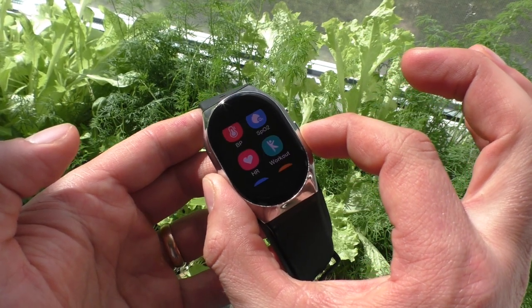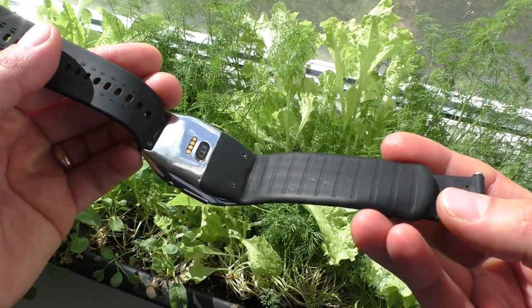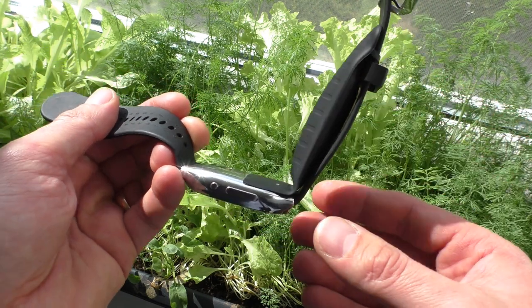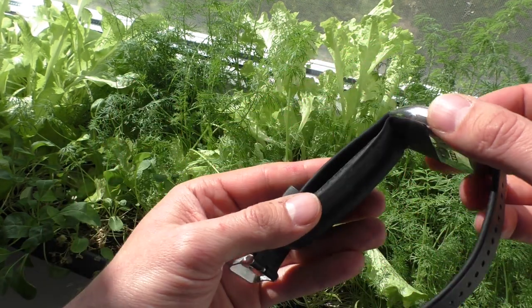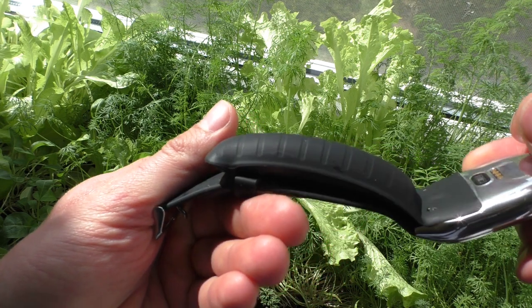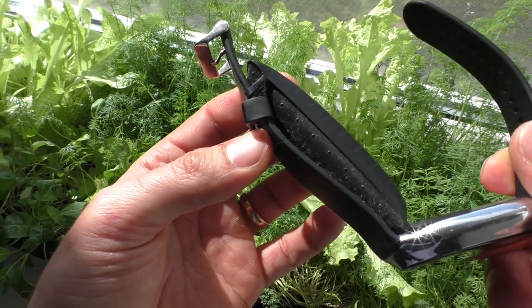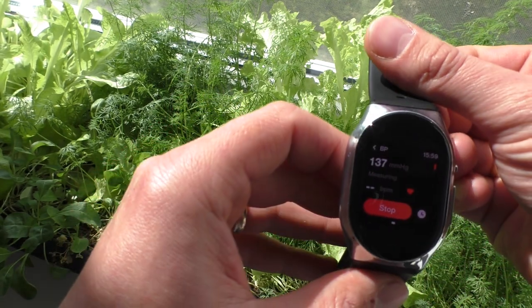Now, before I measure my blood pressure, let me show you how it works. Just hold this big button and it starts inflating this pillow on the strap. It looks crazy — just look at it. This pillow is very soft and it feels very nice on the wrist. It's so crazy that this watch has a mini air compressor inside that inflates this pillow, and it inflates pretty well. It's a crazy looking device.